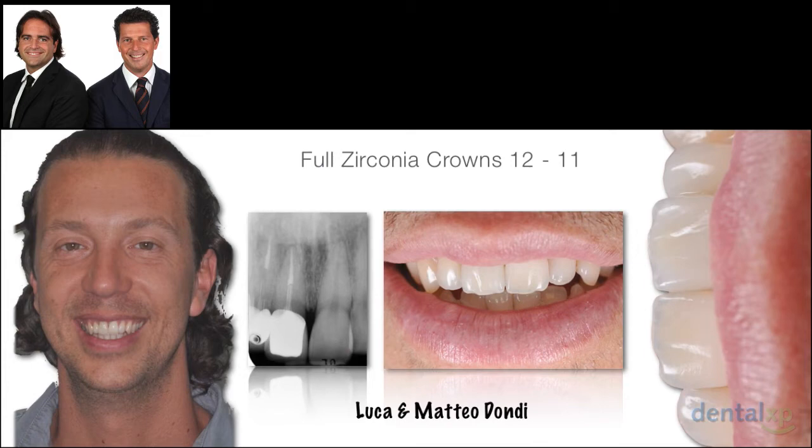Again, the final restoration in place, with two full zirconia crowns on number 7 and 8. 12 and 11 is of course the European classification of the teeth. You can see the X-ray, so you can see the fit of the crowns. You can see the great work of Luca and Matteo Dondi, and you can see of course the face of the patient, that is always important to evaluate, to see how the smile blends in with all the face of the patient.